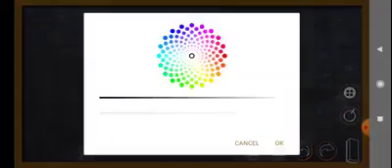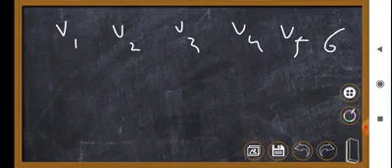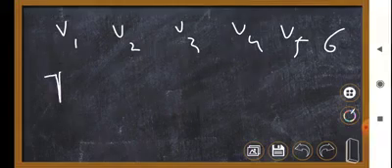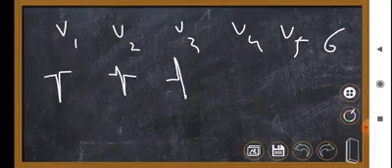If I draw the ECG complexes like this, for leads V1, V2, V3, V4, V5 and V6, we observe something like that. V1 is negative, in V2 there is a slight R wave, and in V3 there is almost balancing of the R wave and the S wave.